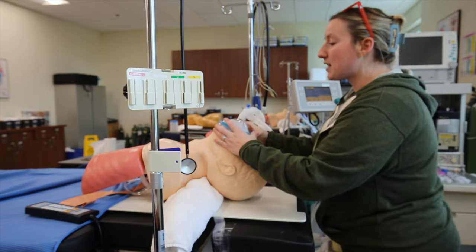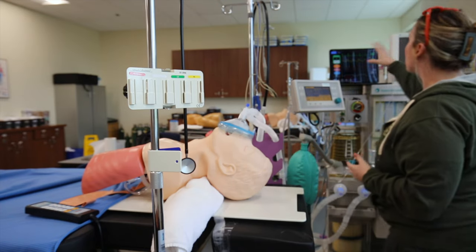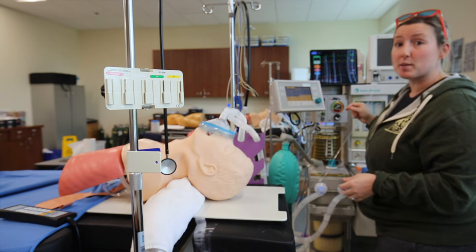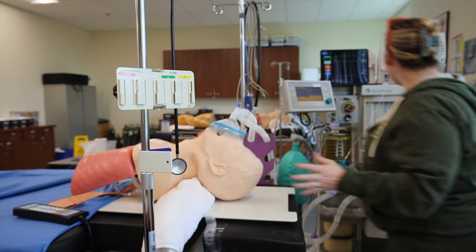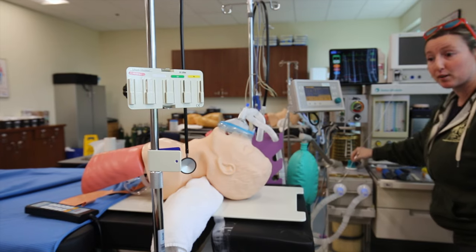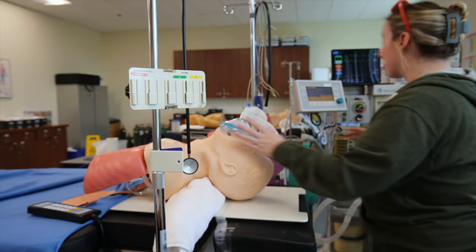At this time we're going to do an anesthesia timeout. I'm making sure that all my vital signs look great, I have good waveforms, nothing's disconnected, his end-tidal O2 is above 80. I have the correct patient, we have the correct procedure. My oxygen is on, my vaporizers are off, I'm still in bag mode, and my APL is open. At this point I feel comfortable to do my induction.